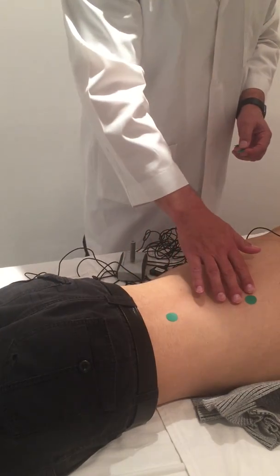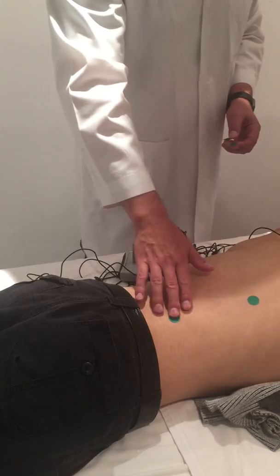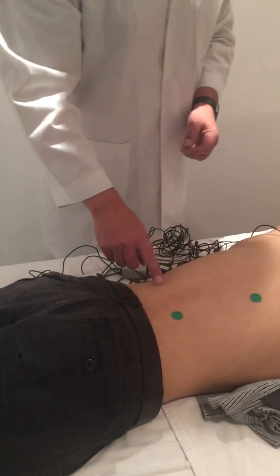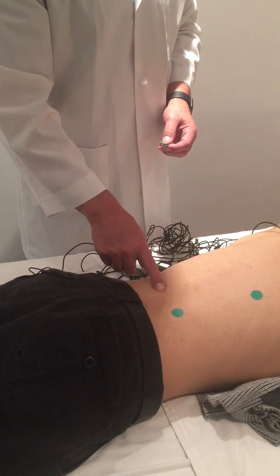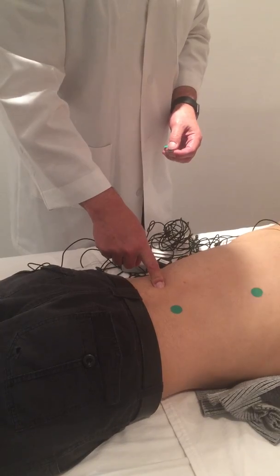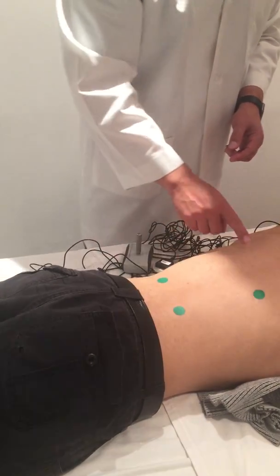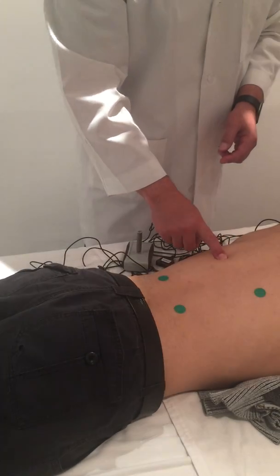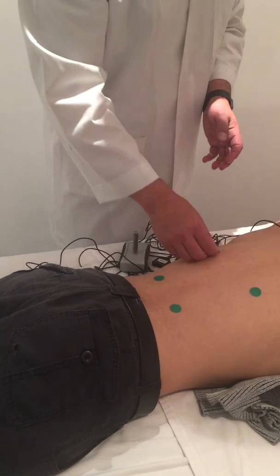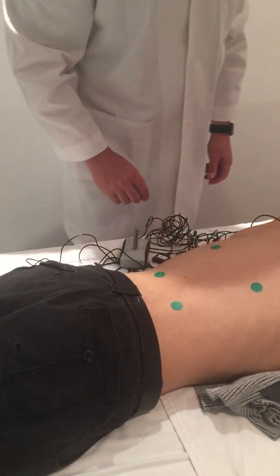We can mark these with pen, or we can use different colored electrode tabs to identify our symptomatic and control sites. So he's complained of low back pain, so we know he's going to be tender over here. Is that tender? 6. Okay, so we know that's going to be a 6 out of 10. And now we're going to try to find another spot. 1. Okay, so this is a non-tender site. So now we've identified our 4 sites for our complete test.